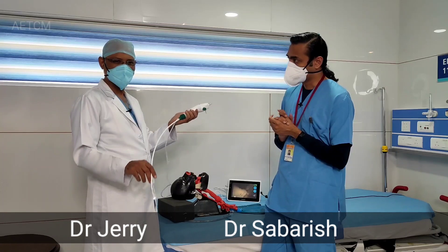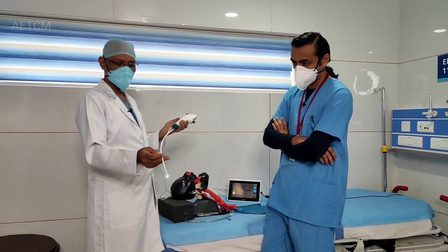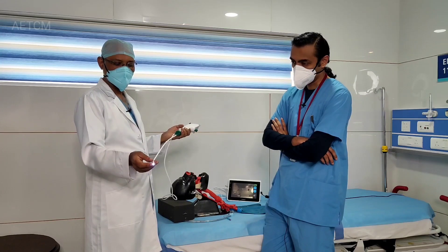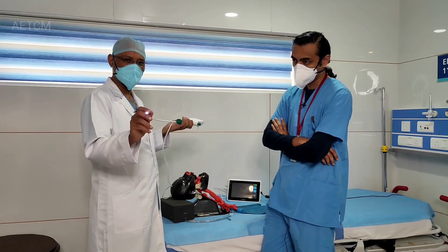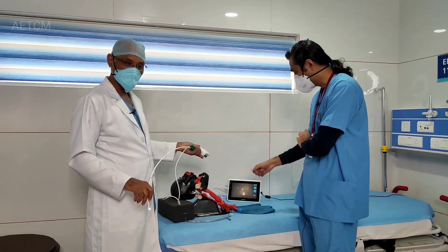There are so many varieties. This is one of those disposable types available. As you can see, this is the scope — the flexible scope which will have a light source, a suction channel, and also a chip at the tip which transfers the image to the screen that you see there.